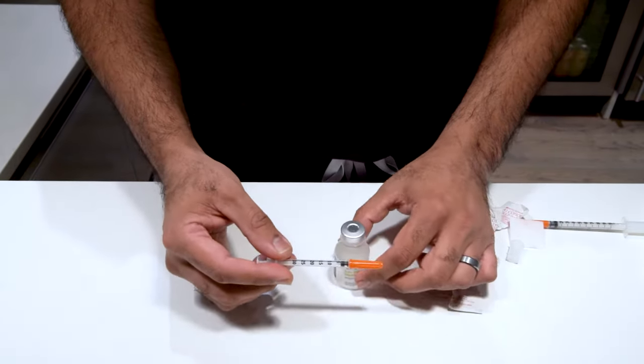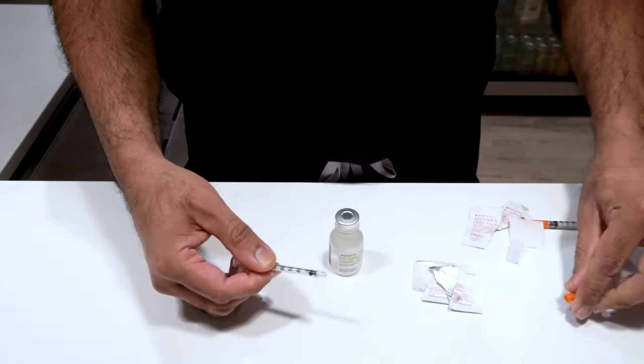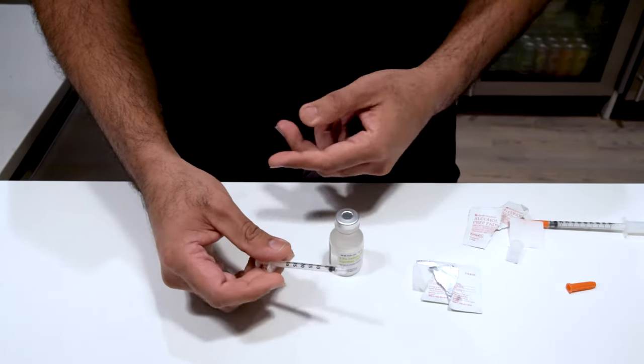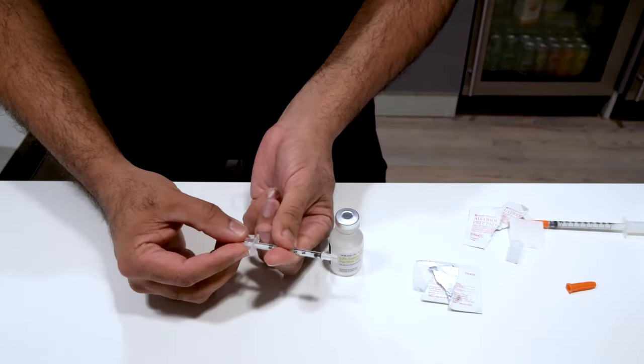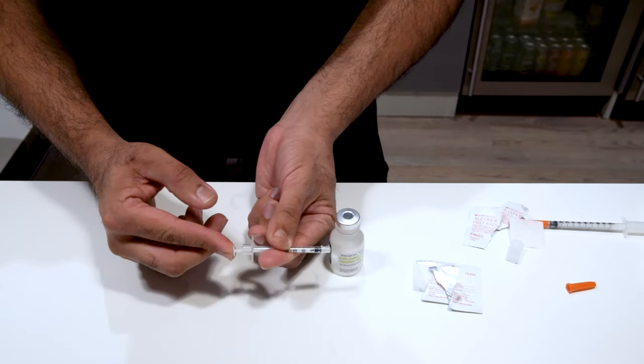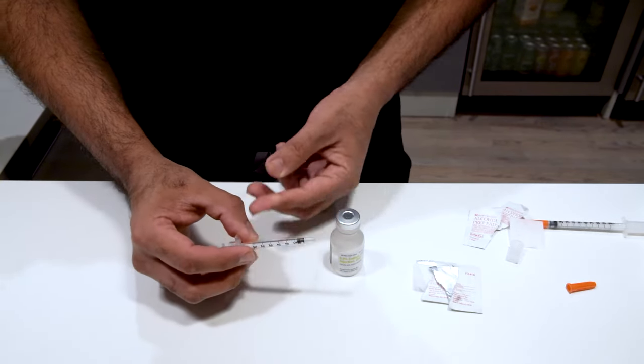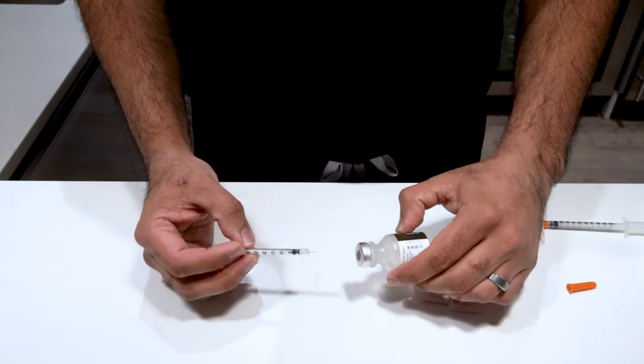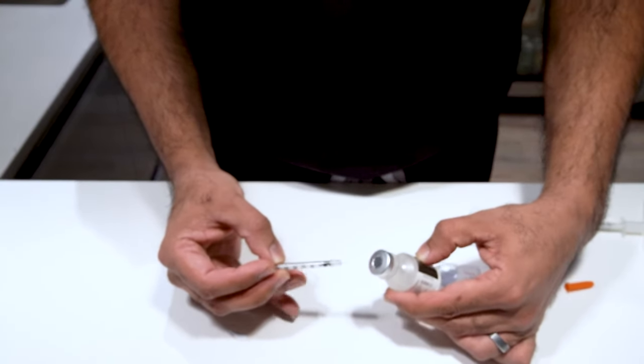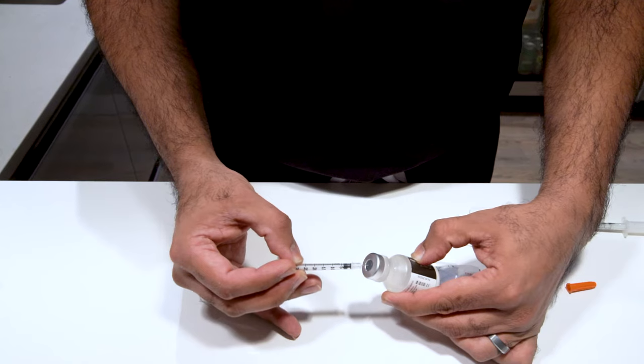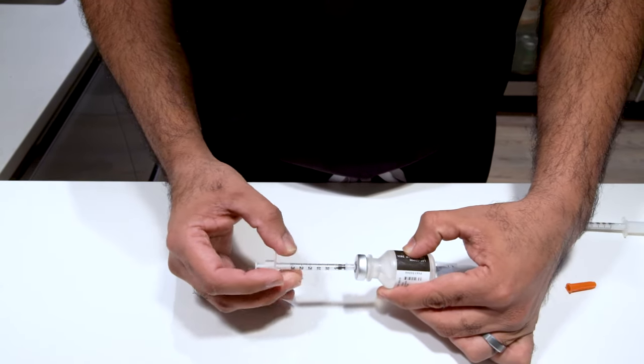Next, we're going to take our syringe, take off the needle cap. Be very careful from this point forward. Making sure that our plunger is pushed all the way to the end, remember, just going to push it all the way through. The easiest way to get the medication out is to hold it sideways, aim right for the center with your needle, and push it all the way in.